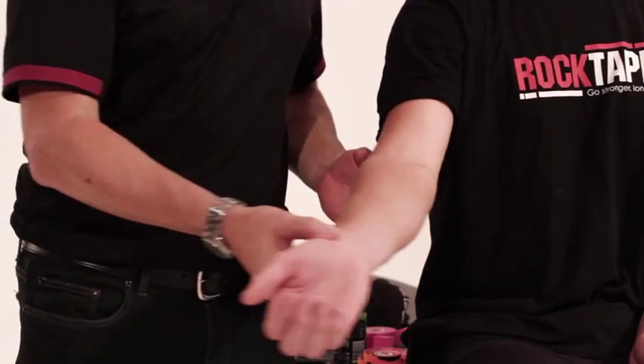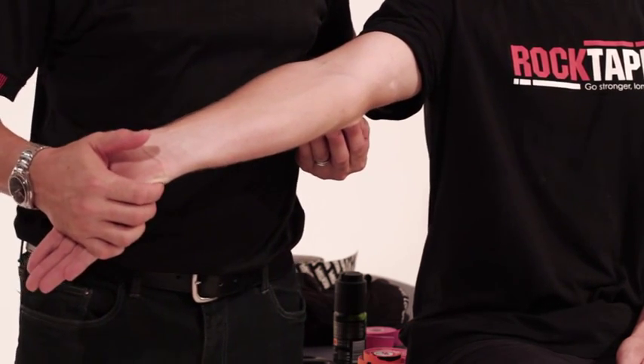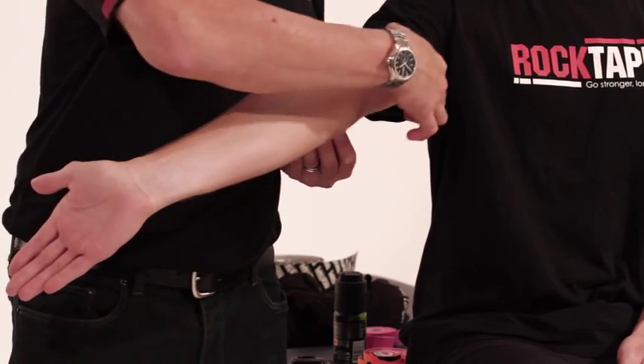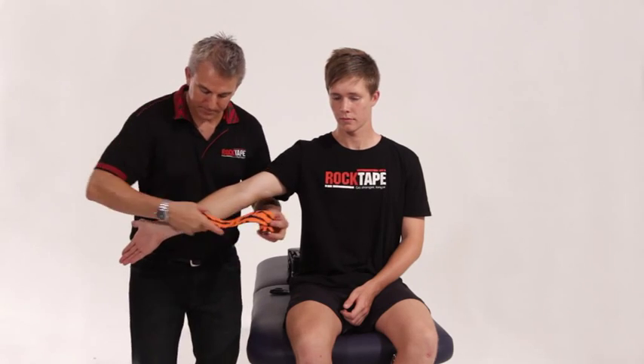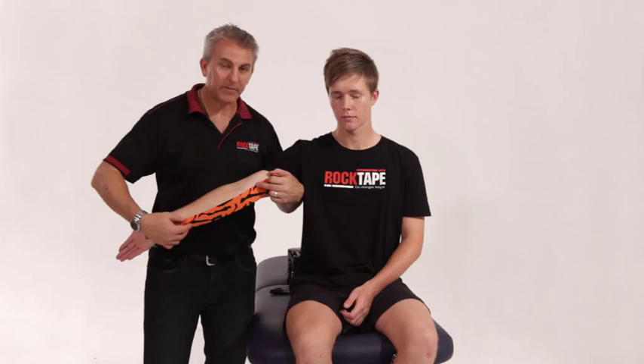When we do this application we always follow a few principles. The first one is to put the patient into a stretch position — they get their hand up and out and around so this part of the arm is nice and stretched. When we measure it, we measure from basically the inside of the wrist to just above the elbow.